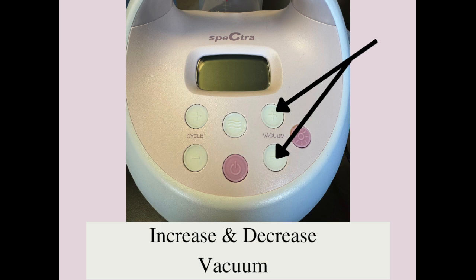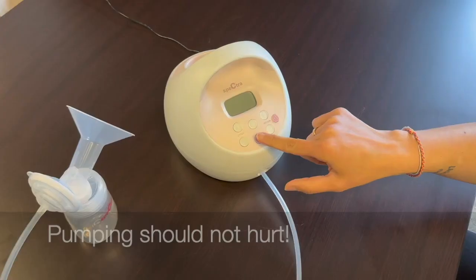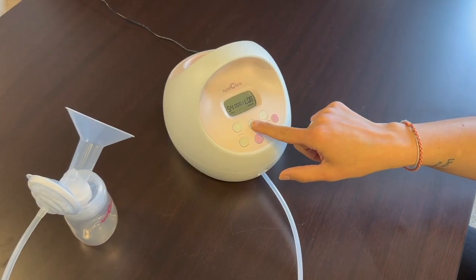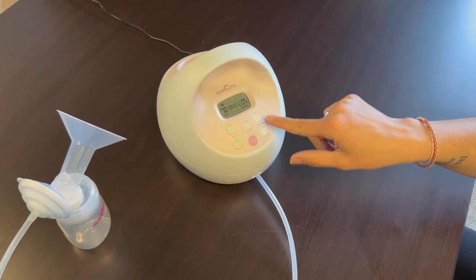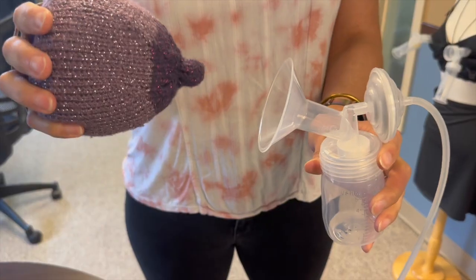The two buttons on the right adjust the suction or vacuum. You want to put the suction to the highest level that is still comfortable for you — pumping should not hurt. In the massage mode you can take it from vacuum one all the way up to five, and in the expression mode you can go from one to twelve. You're just going to find your comfort zone.